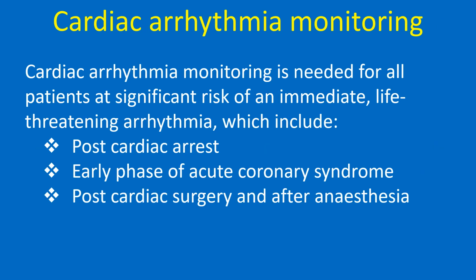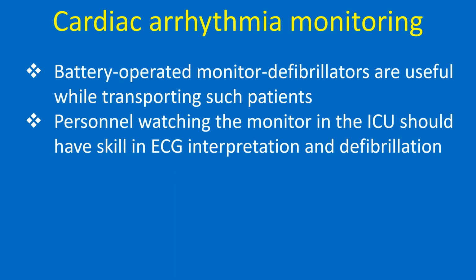Cardiac arrhythmia monitoring is needed for all patients at significant risk of immediate life-threatening arrhythmia, which include post-cardiac arrest, early phase of acute coronary syndrome, post-cardiac surgery, and after anesthesia. Battery-operated monitor defibrillators are useful while transporting such patients. Personnel watching the monitor in the ICU should have skill in ECG interpretation and defibrillation.